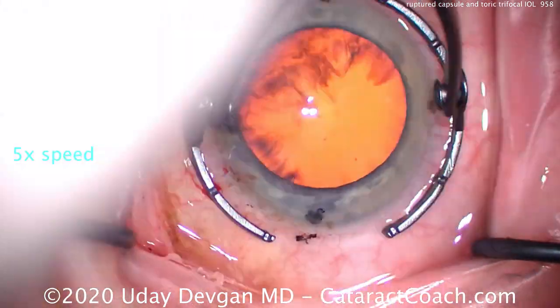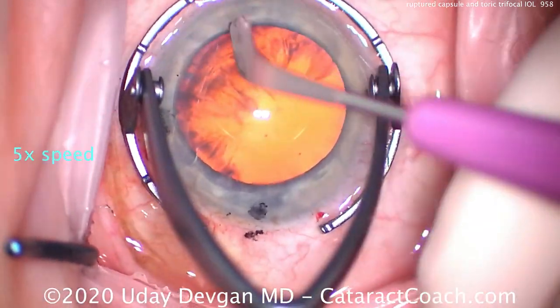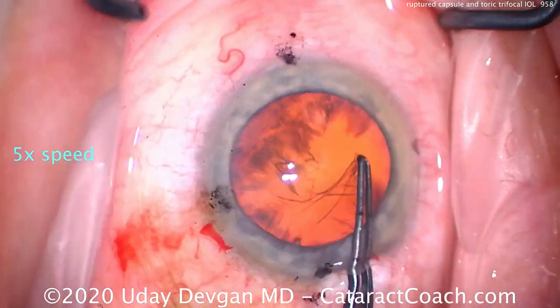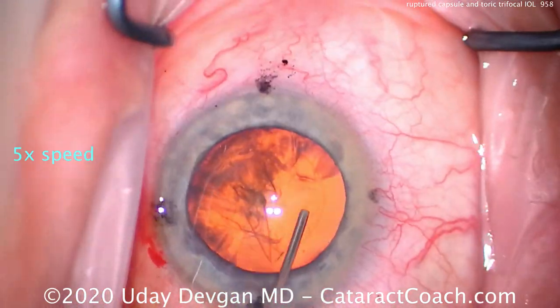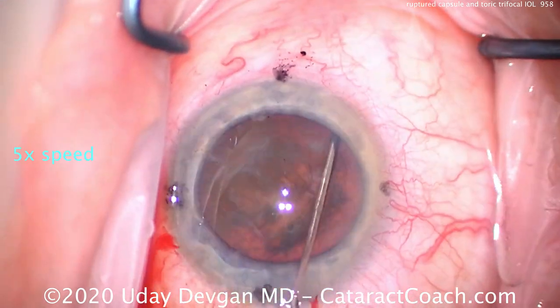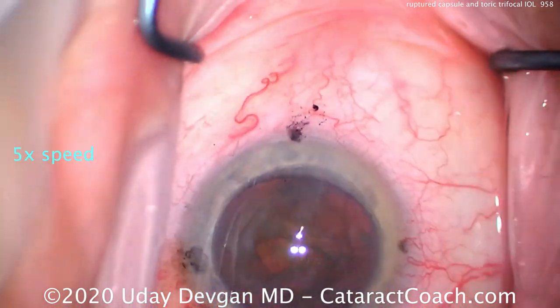We'll speed up the video to get through it all. It looks pretty routine — making the phaco incision here on the steep axis. The black ink marks show us the cardinal meridians. Normal capsular access, good zonular support. A little hydrodissection being performed — again, all pretty routine.